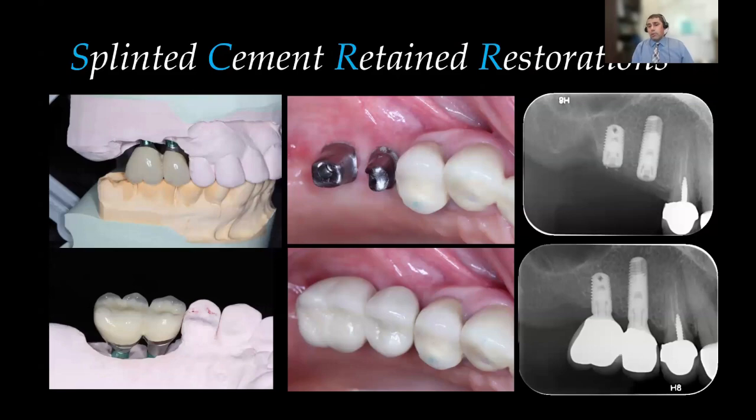And here's an example. You have two implants. One of them is a little bit shorter. The decision was made here not to do a sinus lift, but rather go with the shorter implants and splint both those implants with a wider base, resulting in a very solid biomechanical concept here for this patient that can result in a very long-term success. Obviously, if you have a complication that may happen here, well, it affects that whole segment and might result in a bigger problem for you.